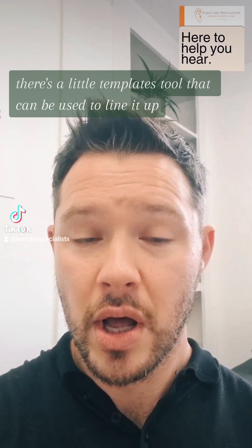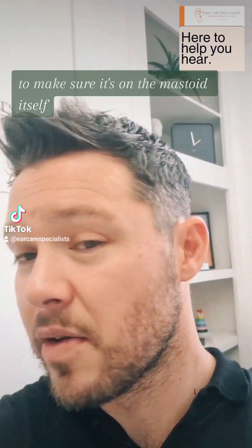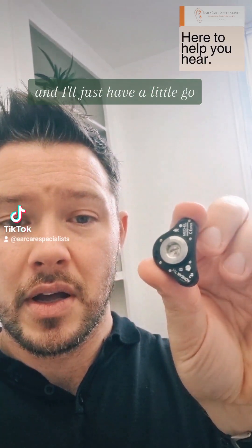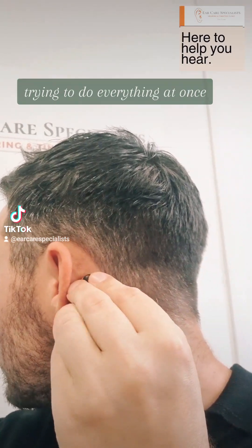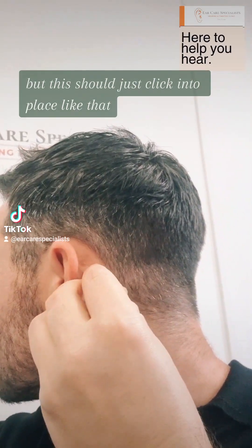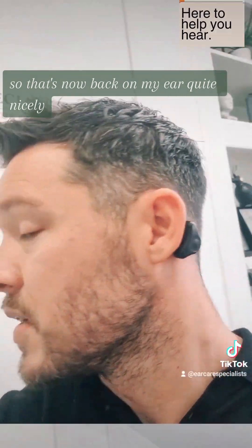There's a little template tool that can be used to line it up to make sure it's on the mastoid itself. I'll just have a go at popping this back on to my ear — this should just click into place like that. So that's now back on my ear quite nicely.